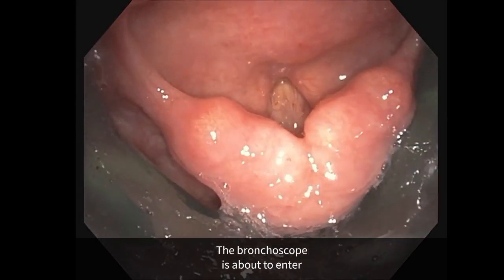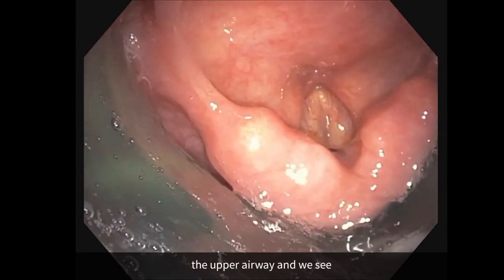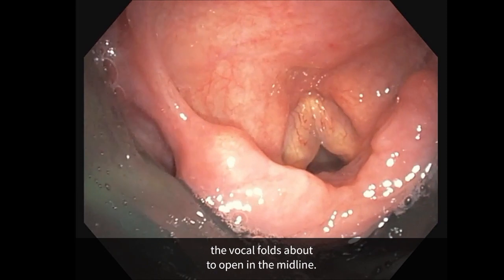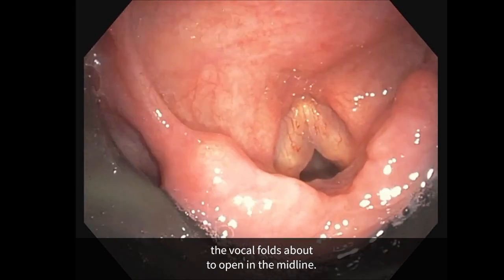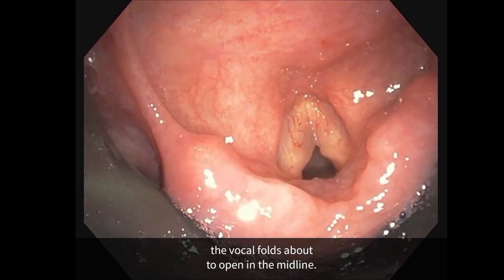The bronchoscope is about to enter the upper airway and we see the vocal folds about to open in the midline.